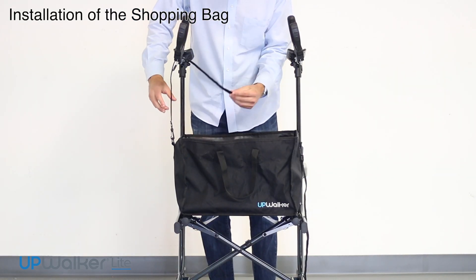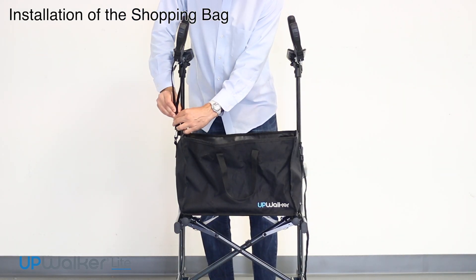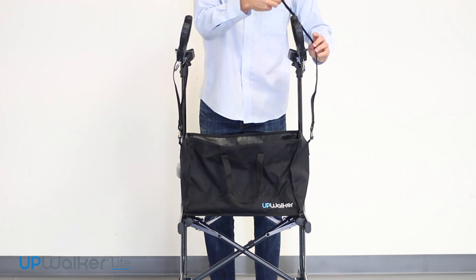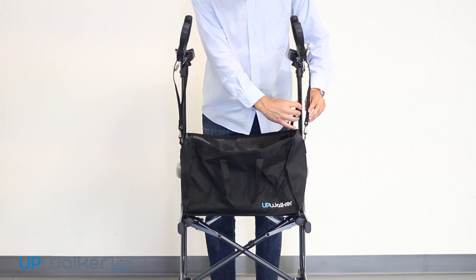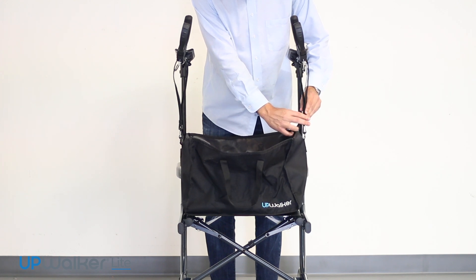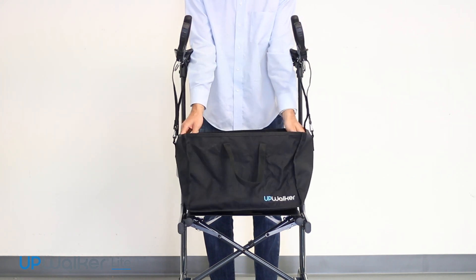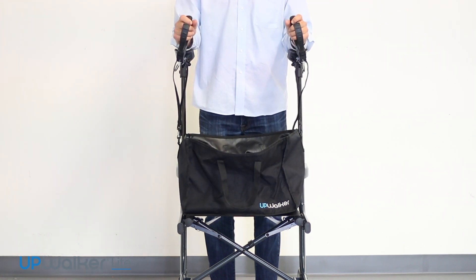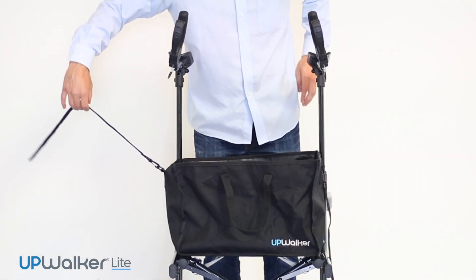Next I'm going to describe the installation of the shopping bag. The shopping bag will sit on the seat underneath the hand grips. When placing the shopping bag on the seat, you will notice that there are straps on the left and right side, which should be placed over the hand grip arms on the left and right hand side.